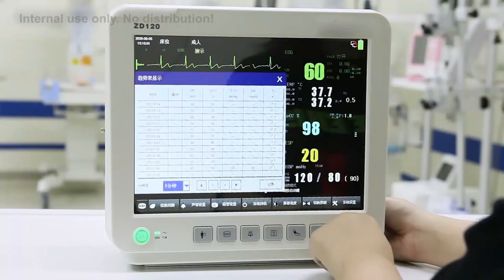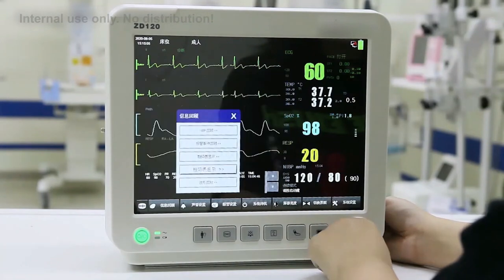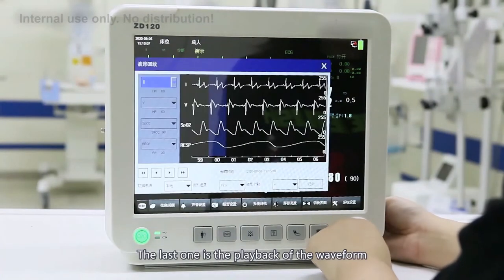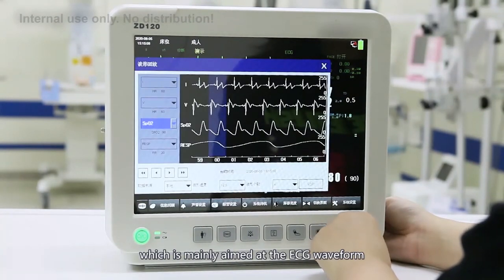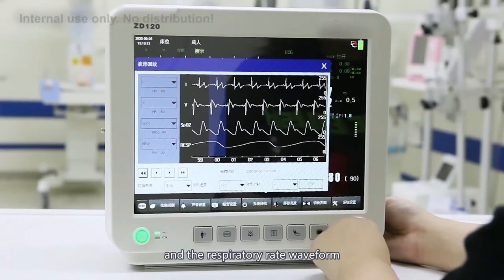There is also a trend list, which records a set of data at regular intervals in list format. You can select the recording interval here. The last item is waveform playback, which is mainly for the ECG waveform, blood oxygen waveform, and respiratory rate waveform. These are the contents of the review interface.